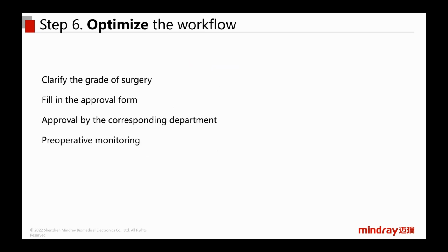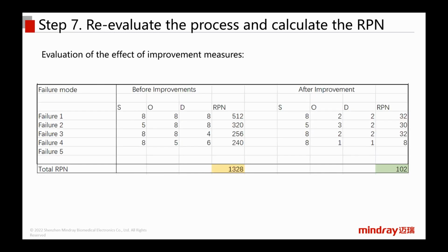Of course, we don't stop here. We're not going to do one analysis of how much of a problem we have for now and just stop. After the first round of analyzing each indicator separately, we have to optimize each section in our workflow from step number 3 accordingly. After applying these possible or difficult improvement sections, we will need to do another round of indicator rating to get the risk value after improvement.